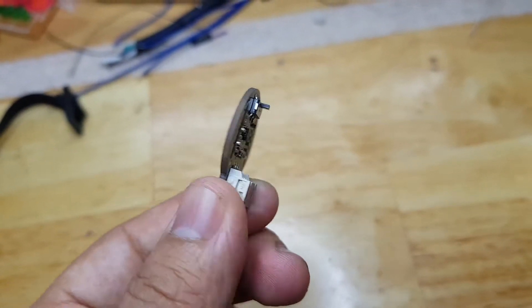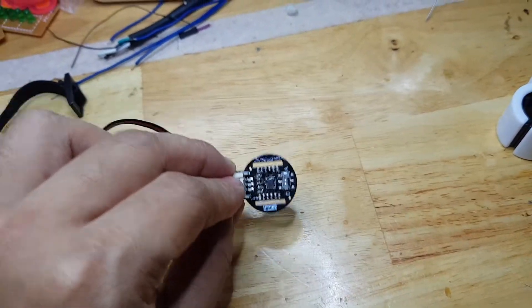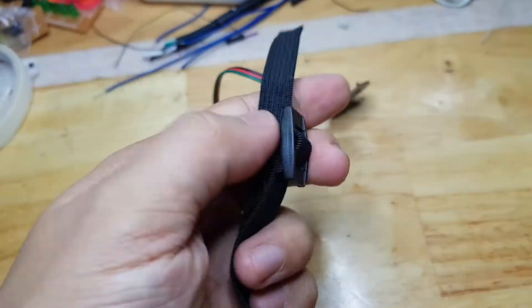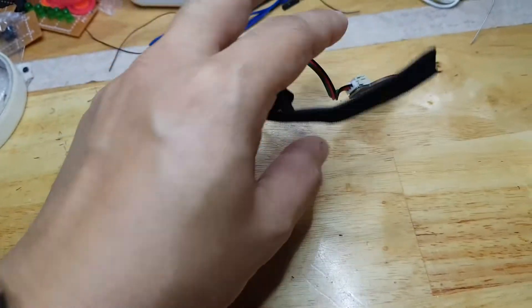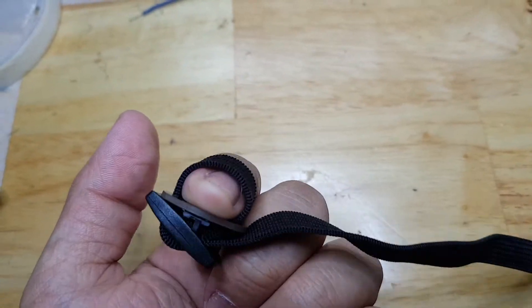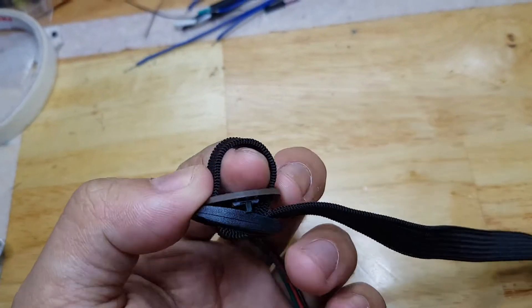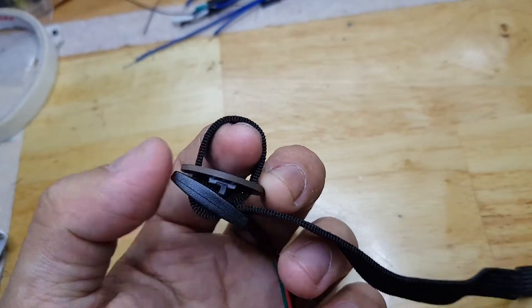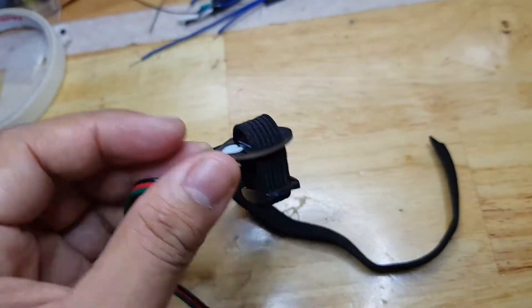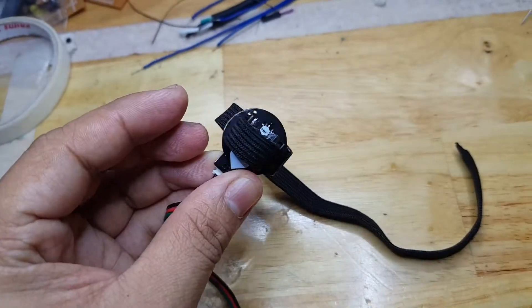This is a DF Robot heart rate sensor and I'm going to use it on one of my projects. Unfortunately, there's no good housing for this. DF Robot has this garter that you can use so that you can fit this on your finger. I tried to hook the mechanism that DF Robot put on their kit and this is how it looks like. It seems to be sturdy and it really keeps my finger there, but I don't like this kind of setup. So I need to look for a way to make an enclosure for this so that I can clip it on my finger and measure my heart rate.